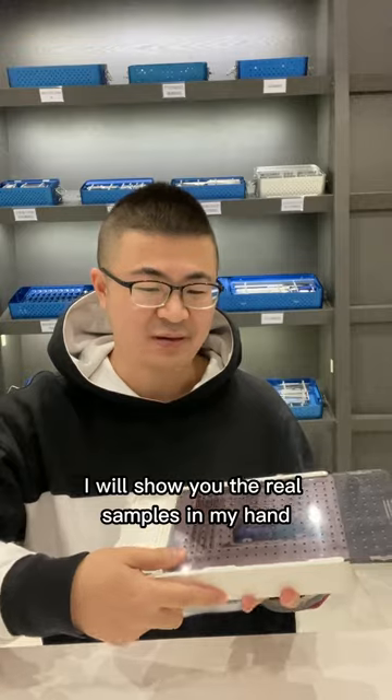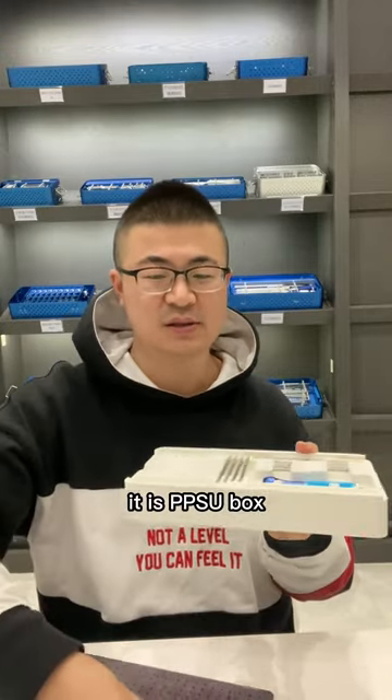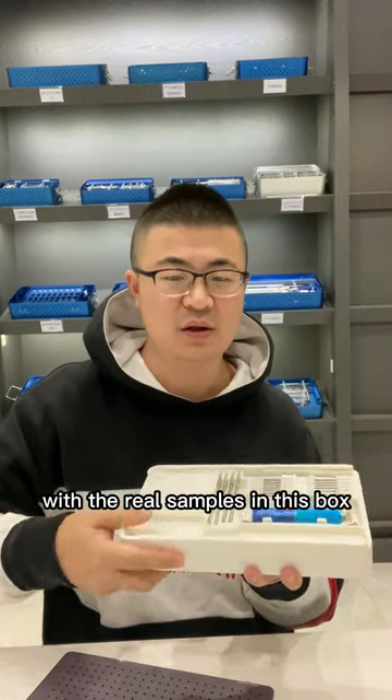I will show you the real samples in my hand. For this instrument set, it comes in a PPSU box. Next I will show you all the details with the real samples in this box.